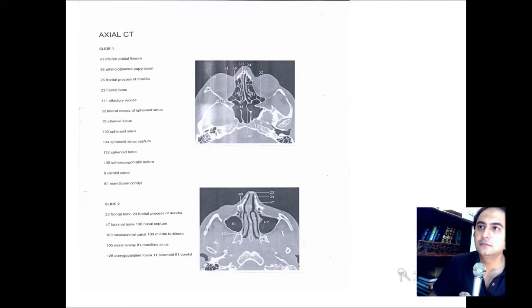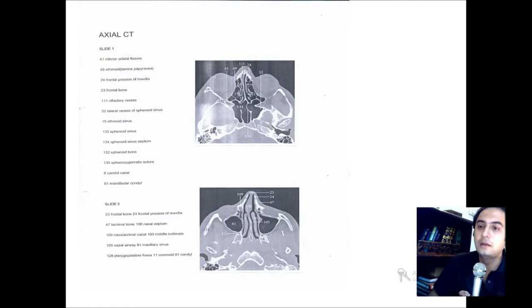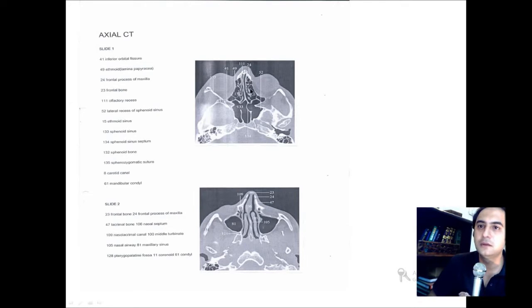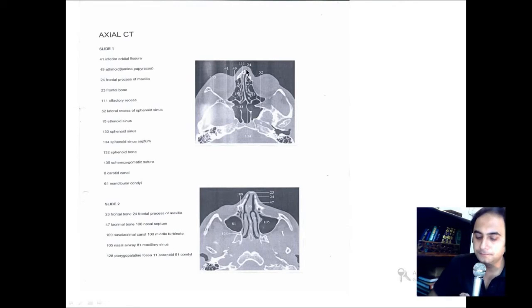Axial section — this is the basic CT. Everything in the CT scan can be identified on an axial CT. The coronal CT and the sagittal CT are just supportive. Now, starting with the axial slices, here you see these small hypodense areas — these are the ethmoidal sinuses, and they are frequently large in number. In the midline, you can see the nasal septum. Number 23 is the frontal bone, the part of the frontal bone that is visible.